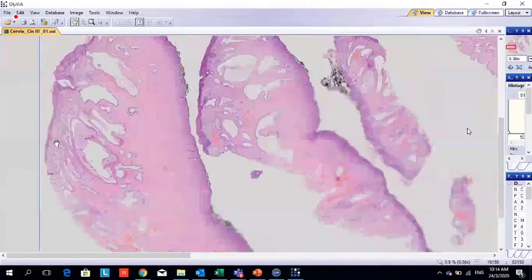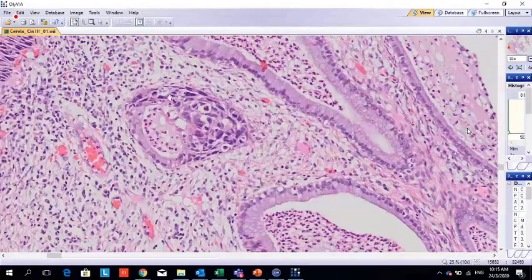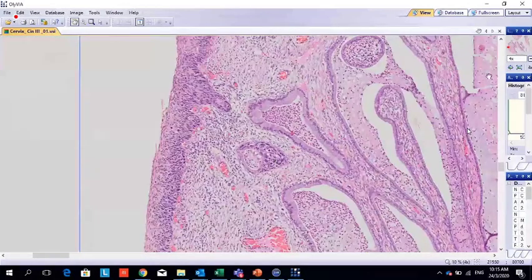If you see this one, you will tell me, oh doctor, this is invasion. Is it invasion? See? No. So what are these?